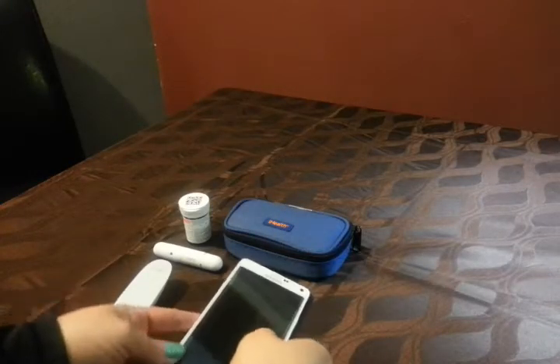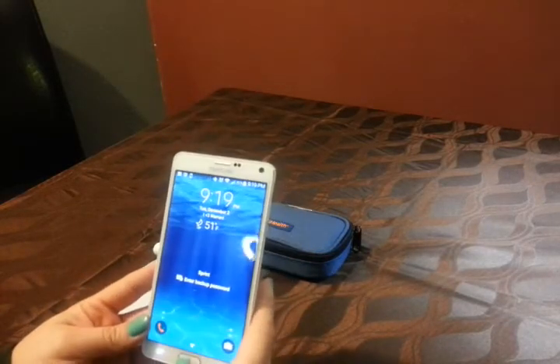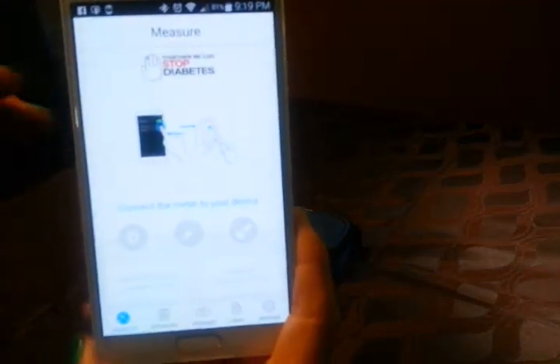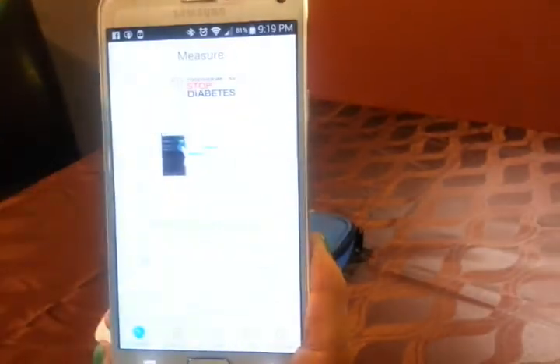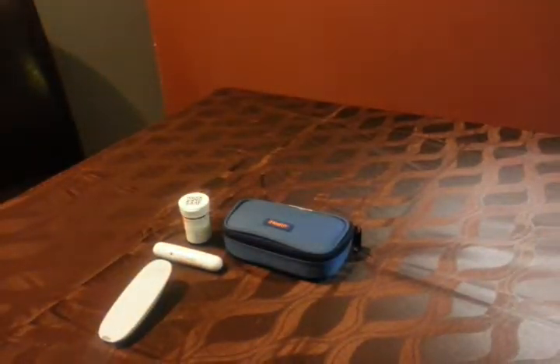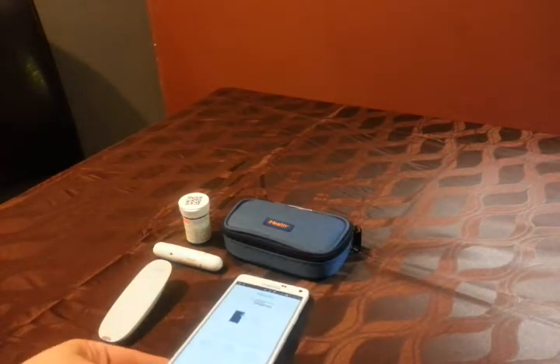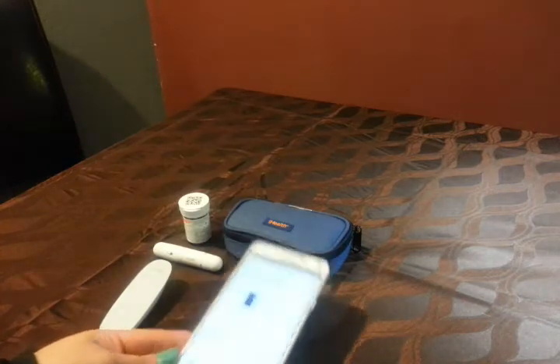First things first, let's go ahead and open up the app on the cell phone. This is what it looks like. What I'm going to do here is show you what this does when I hook it up to my meter.